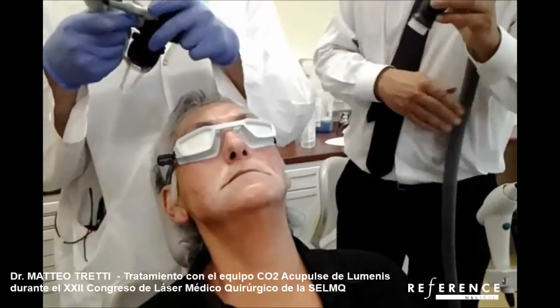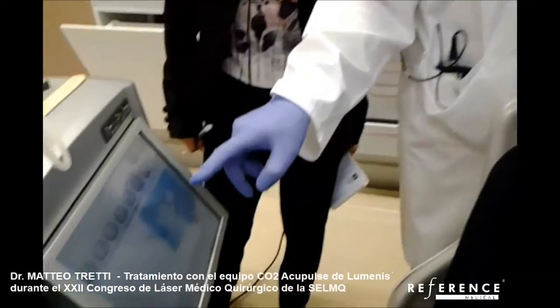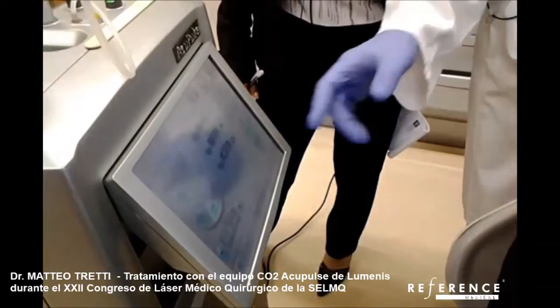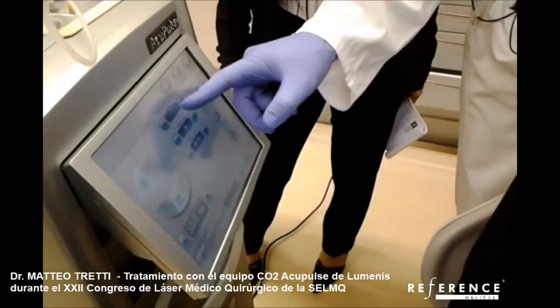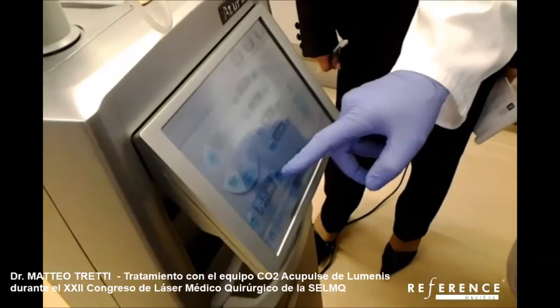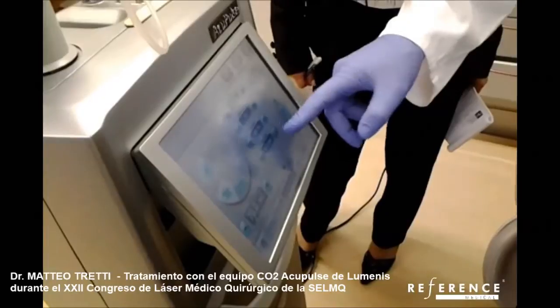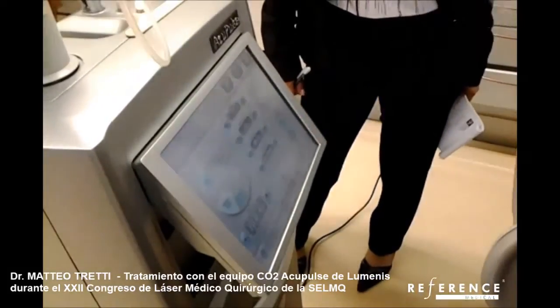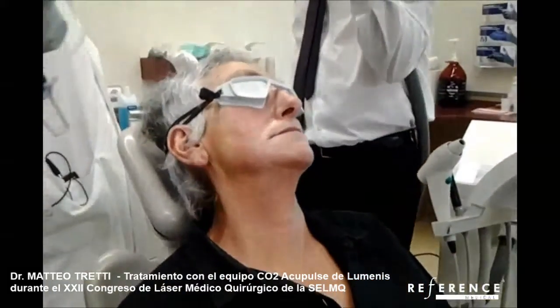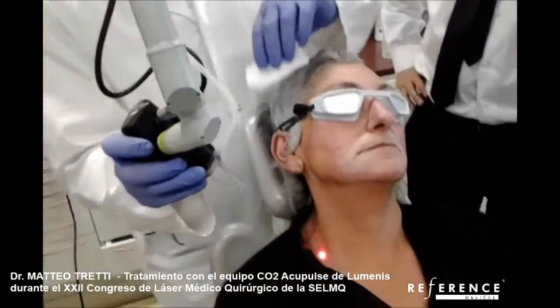The other sides of the face don't need combo mode, so I will choose superficial only. I will use the square shape with coverage of 40%, energy of 70, and the time off as quick as possible — 0.3 seconds between one shot and the other. Another tip here is to stretch the skin. I will use a nose guard to avoid any problems.